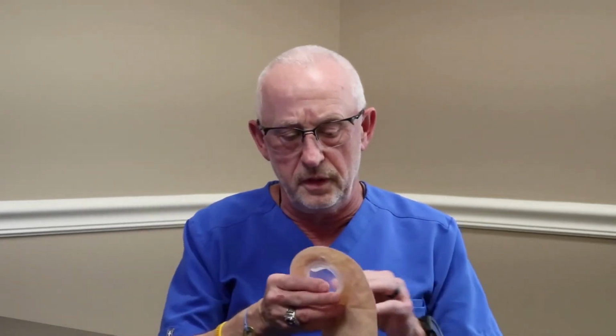The biggest challenge of having an ostomy is that you're pooping from a different place. Ostomies are normally put in the left lower quadrant if you have a colostomy, and sorry if you can't see what I'm pointing to, I realize I'm behind my desk, or in the right lower quadrant if you have an ileostomy. And so the challenges are a result of you're going to the bathroom from a different location, and the stool and waste is going to come out and empty into a bag like this.